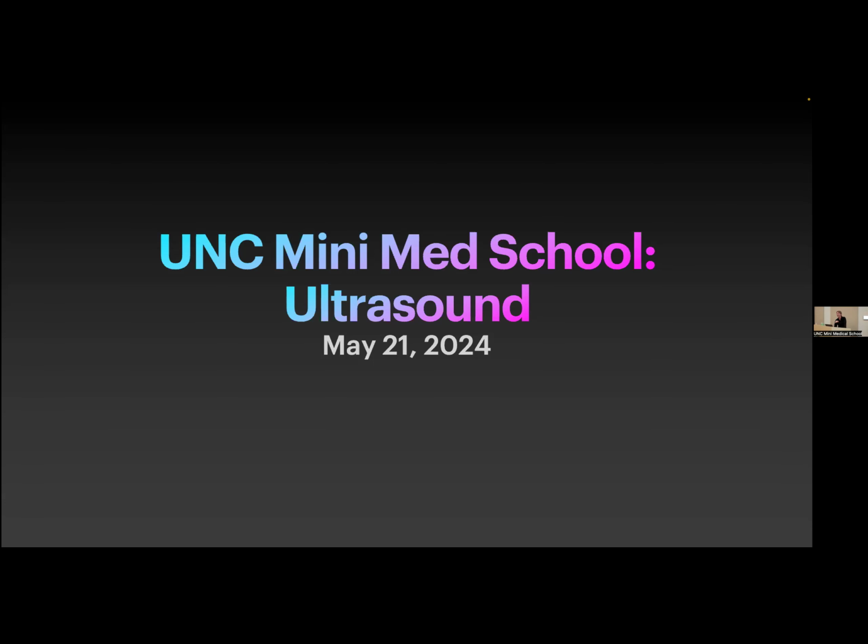Yeah, great question. A CT we can get within a few minutes, sometimes a minute or two even. We can have the patient hold a breath and do a full CT chest, abdomen, and pelvis and be done. MRI, if you're looking for chest, abdomen, pelvis of an MRI, you're looking at upwards of an hour or more for that study.